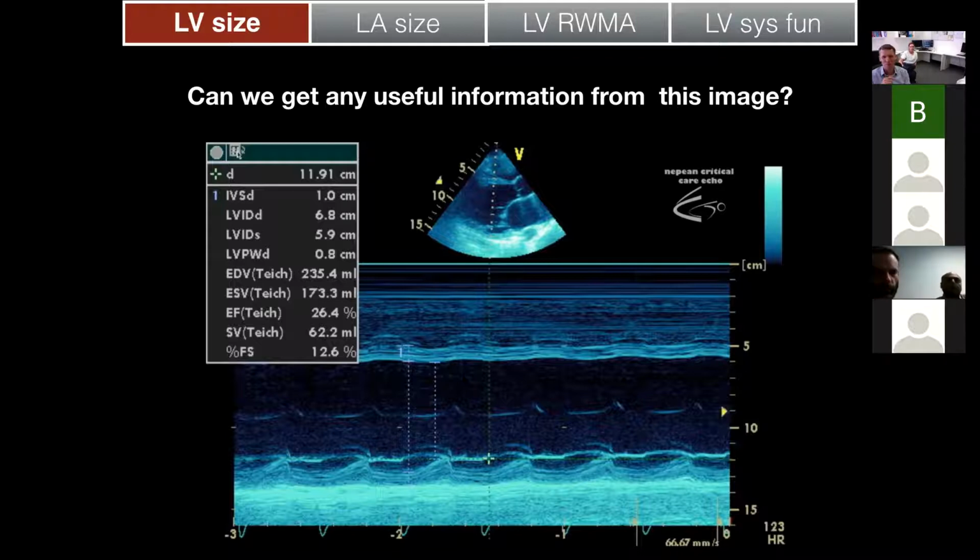And maybe it's been linked to an ejection fraction of less than 40, or basically the valves not being opened up enough. It's a bit like what I call the pseudo-severe aortic stenosis, where the valve doesn't get open because there's not enough blood coming through. Yeah. Pseudo-low flow aortic stenosis, something where if you actually make that ventricle work harder, the valve opens up more. It's just blood flow going through a ventricle and the valve leaflet's not opening up enough. Nice. Yeah. Well done, mate.